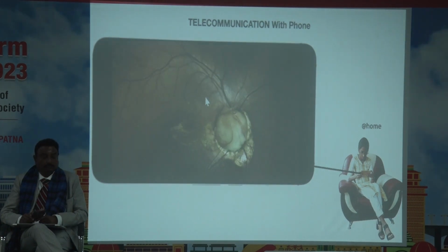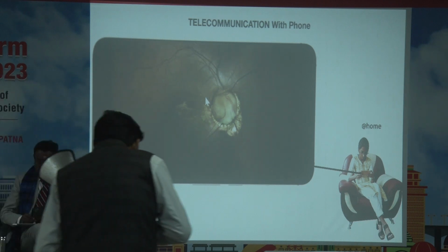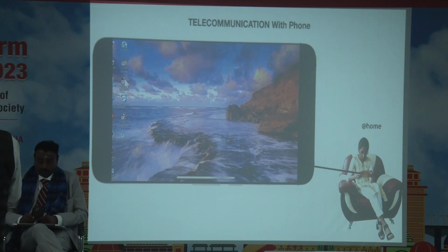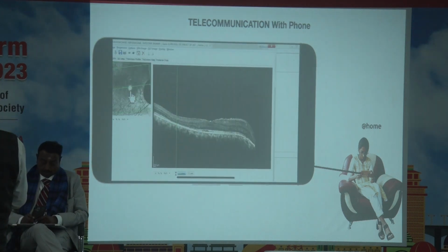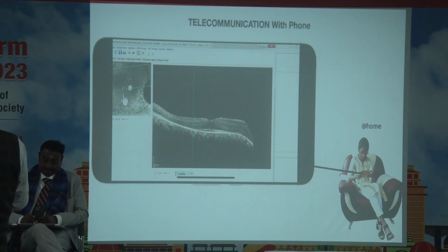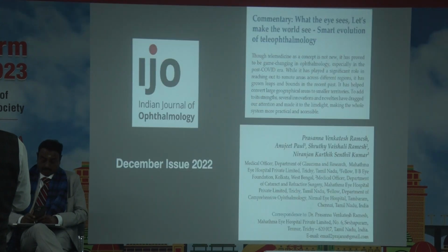So wherever we are, with that particular case history and the MR number, we can access the fundus, we can access the OCT. And in this patient, disc coloboma, the fundus was examined, and then a simultaneous OCT of that same patient was examined in different slices by the doctor from her smartphone itself.